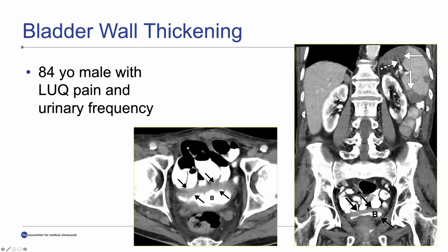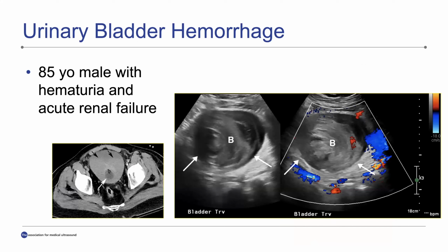of the bladder. And here's another view of the bladder with arrows showing marked thickening of the bladder due to the inflammation from the virus. The bladder wall should be very small, should be thin, about 2 millimeters, and you can see it's markedly thickened. And you can see other abnormalities involving the bladder.